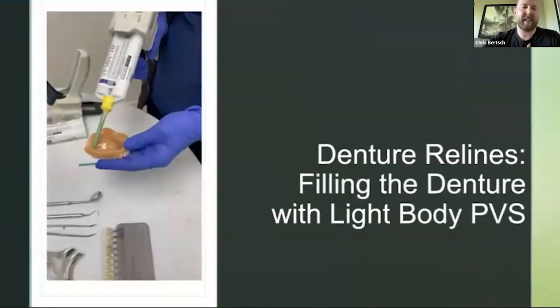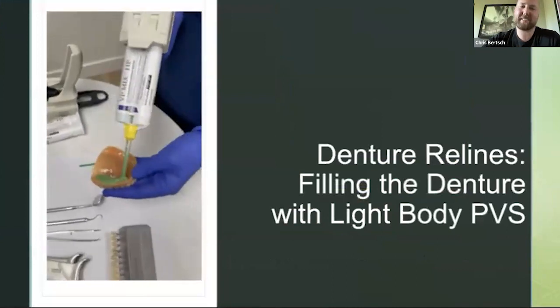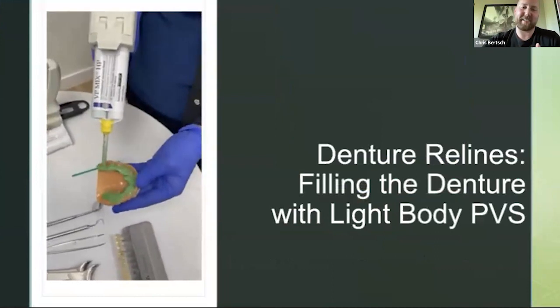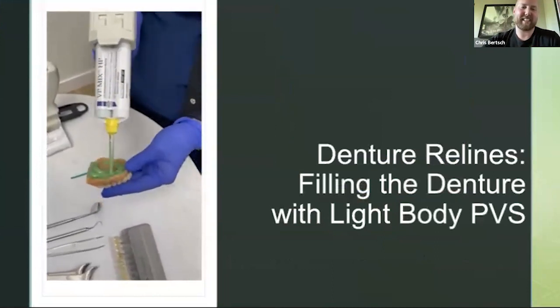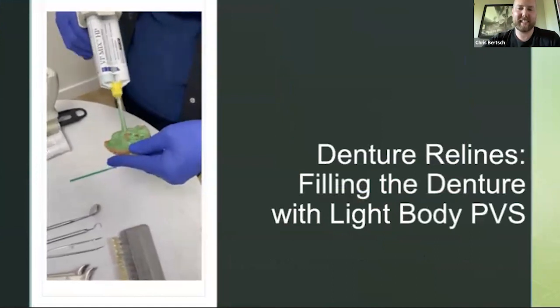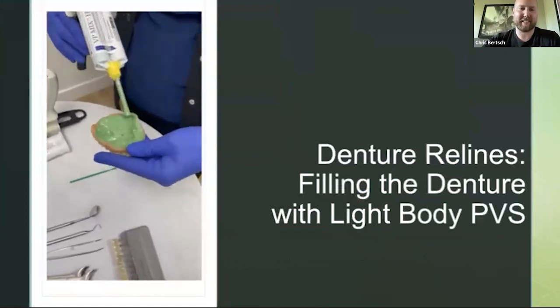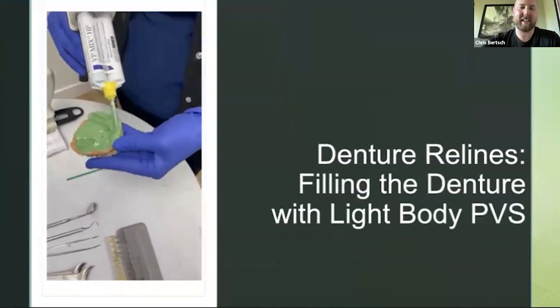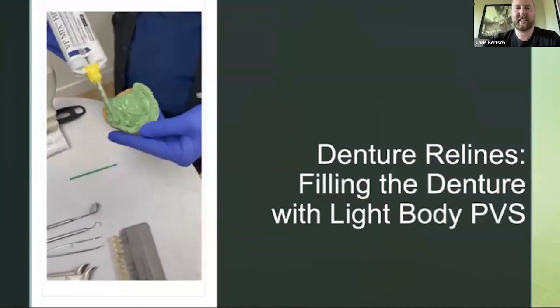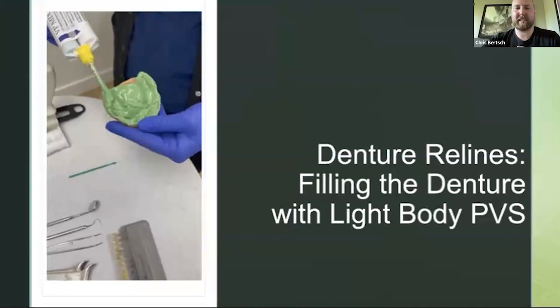Okay, so this is my assistant filling the denture tray. We have some really quality videos today, and it's just to show you our process. So I always get them to fill the ridge, but the integrity of the ridge, the palate, and then just kind of scoop it up or over the denture like that. So this denture, we obviously didn't do any border molding. We didn't need to, but we'll capture the denture there.